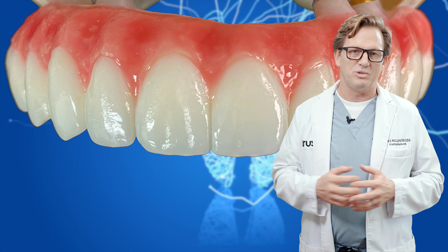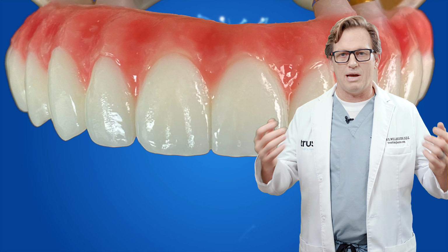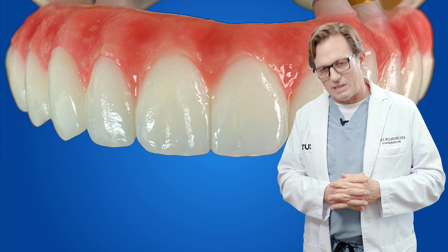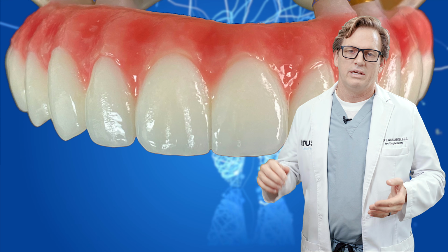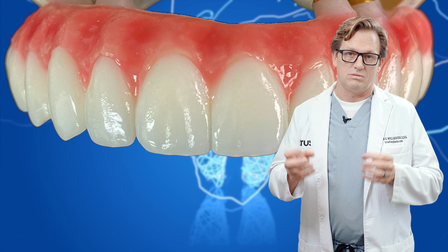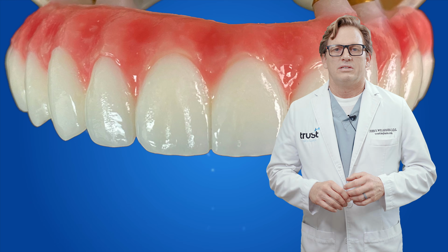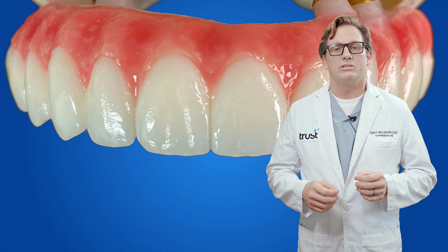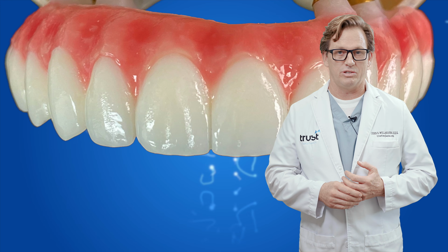All they're talking about is doing all-on-4. And we can do all-on-4 and you come in and you go out in a day and you're happy and you're good to go. But that's really not the case. It is very much more technical and involved than just going in, putting in 4 implants and coming out with a new smile. So it's critically important, the materials, the type of implant, the type of prosthetics, the type of graft material that the doctor uses.